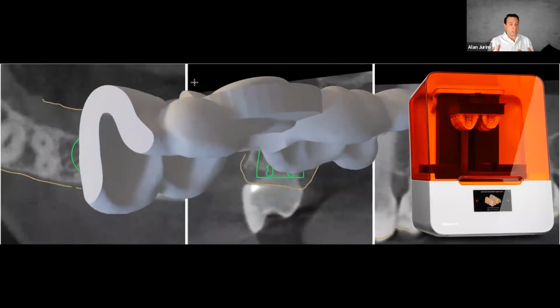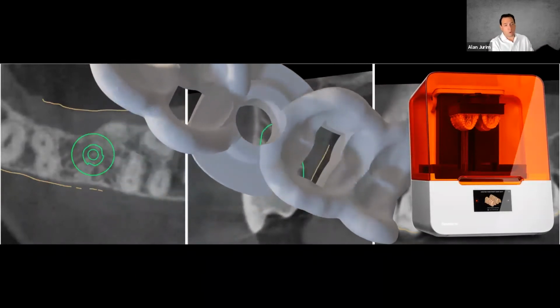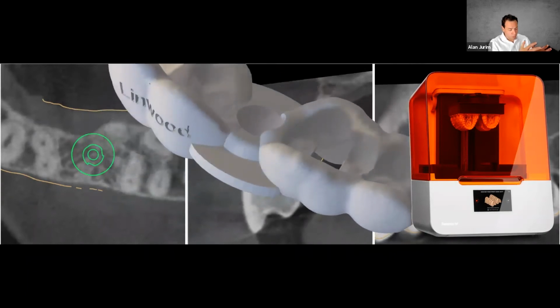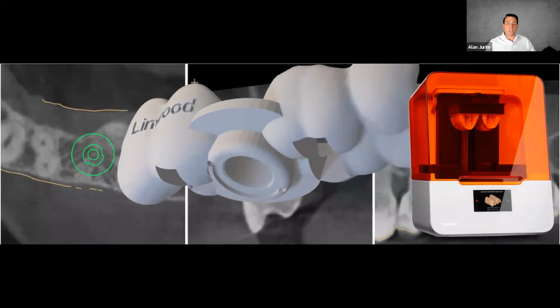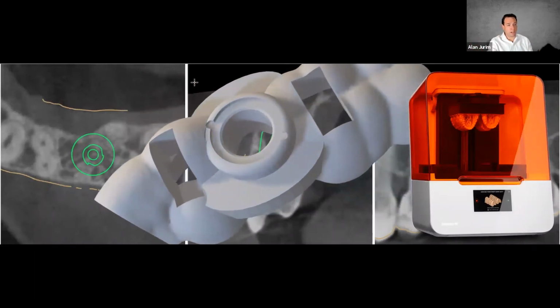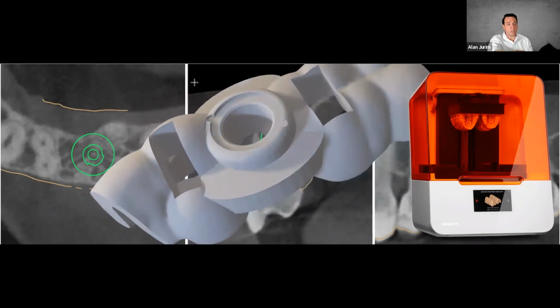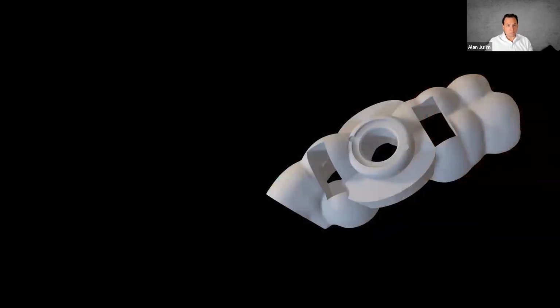So remember, IPO dentistry, in this stage, we're talking about inputting. So we've already recorded the patient's Trio scans, and we've already recorded the patient's 3D bone data. And then we're going to process. So we're going to do a design, which basically means we're going to align all the different data, virtually plan our implant, and then produce what we see here, which is the 3D design for our surgical guide.